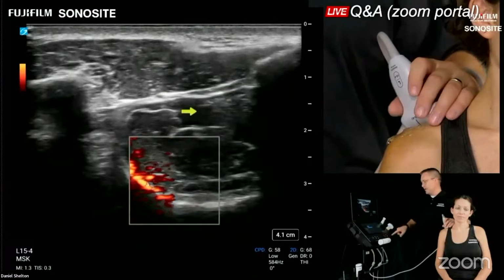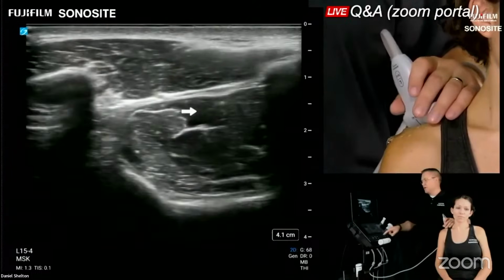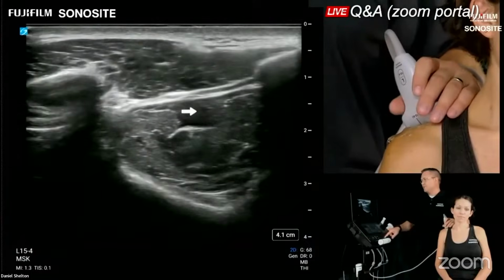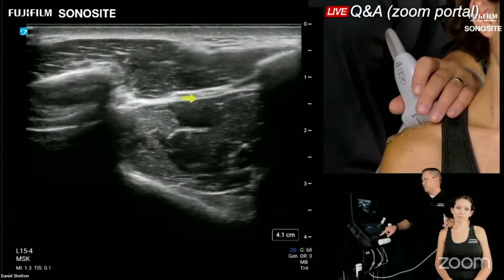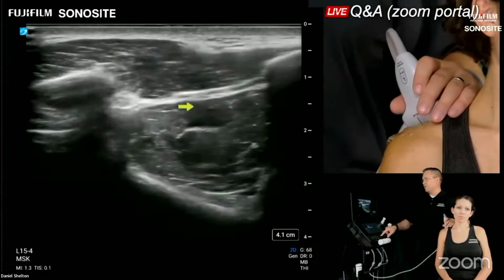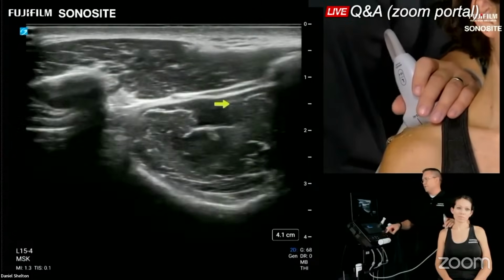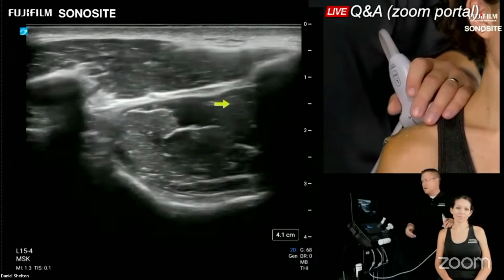Diagnostically, if you're doing an exam on the supraspinatus, as we covered in the lateral shoulder and posterior shoulder, I think we briefly touched on it, this muscle should be nice and dark all throughout, all the way up to that fascial plane. You shouldn't see a dirty shadow or rim around the muscle belly. It should be nice and dark right up to the fascia. So that really concludes the majority of what we do when we're looking at a superior shoulder exam, plus a little extra.